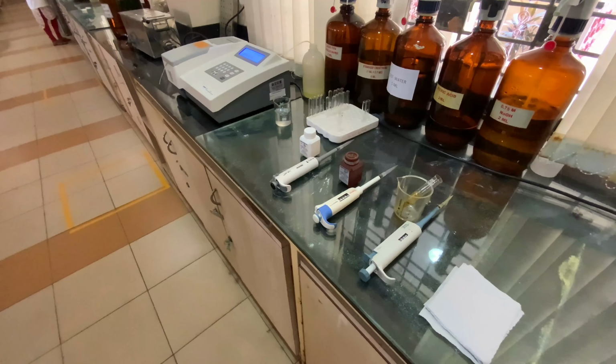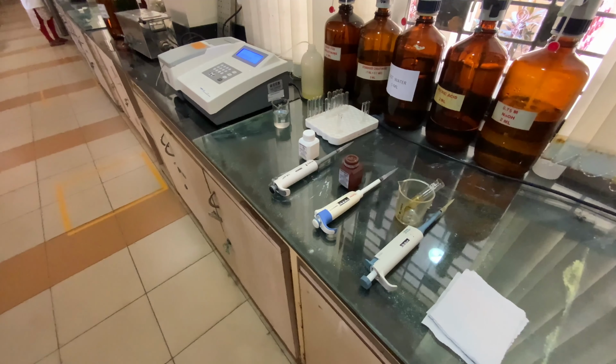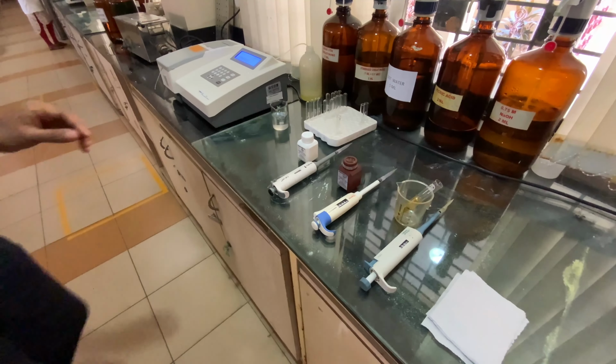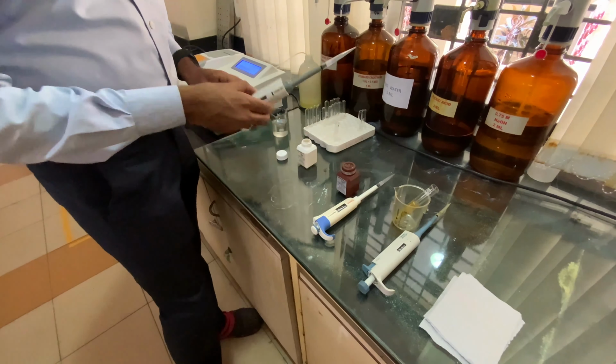The different reagents are then manually added using the auto pipettes into the test tube, mixed thoroughly, and then the sample is added. The sample reagent mixture is mixed.